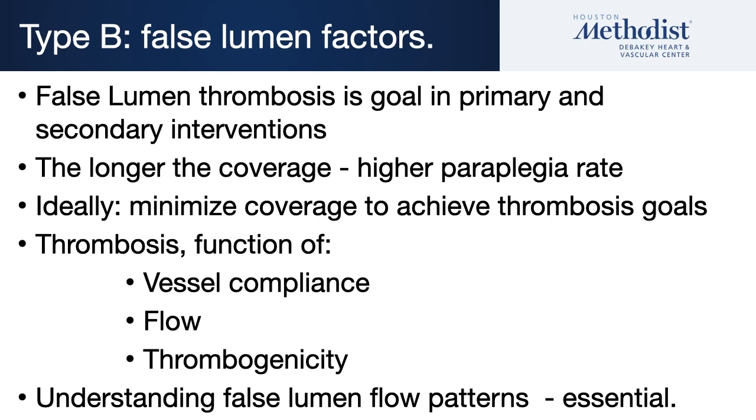What are those factors? And there's probably also a thrombogenic factor that we really don't begin to understand. However, we think that understanding these false lumen patterns and the compliance of the septum are going to be important in trying to make these objective decisions.